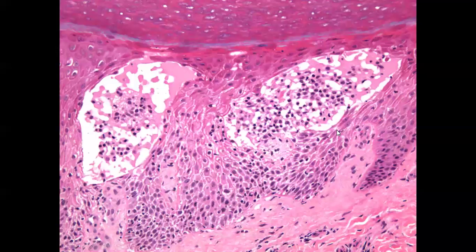So the expected histopathology of vesicular eczema is an extreme degree of spongiosis that leads to intraepidermal vesicles. You can see these large vesicles containing serous fluid and lymphocytes, and the surrounding epidermis shows spongiosis.